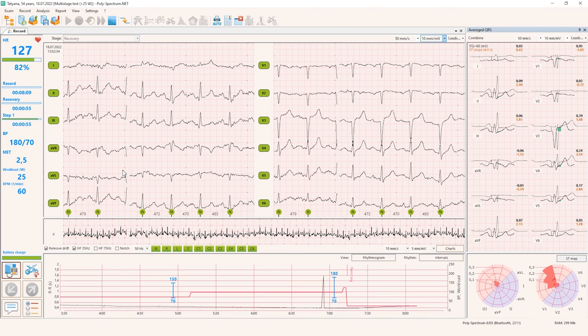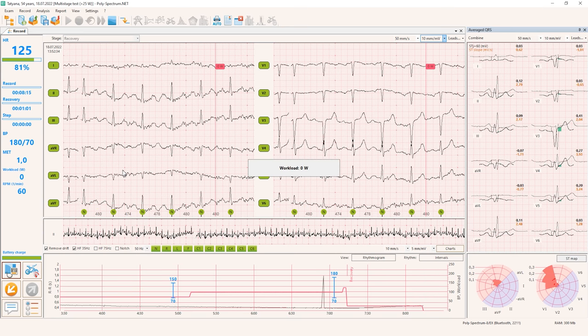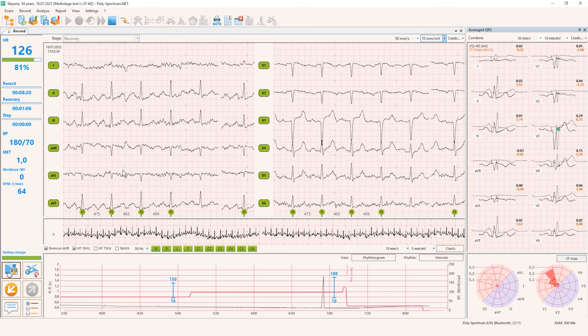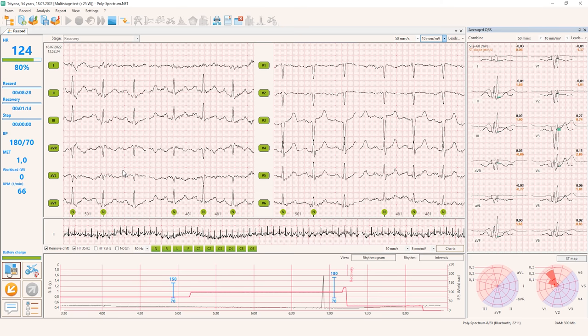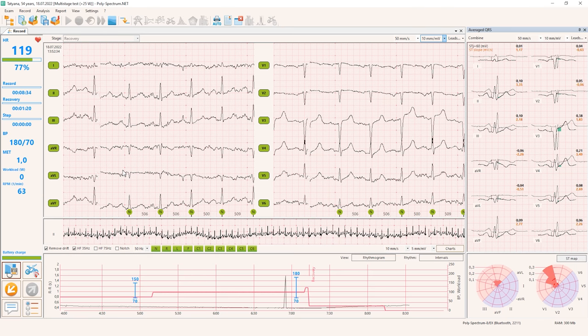And very often the goal is to have 85% of age predicted heart rate. Yes, that's maybe a reasonable point, but please think about this point as a relative reference. You can stop. That's not the rule of thumb that when you achieve 85, you stop the test completely. No, it depends on the clinical situation. If you see that the patient can move further, you can go further.